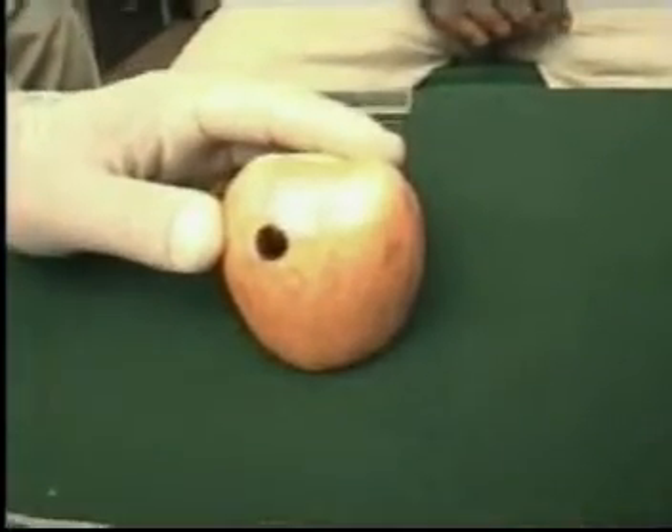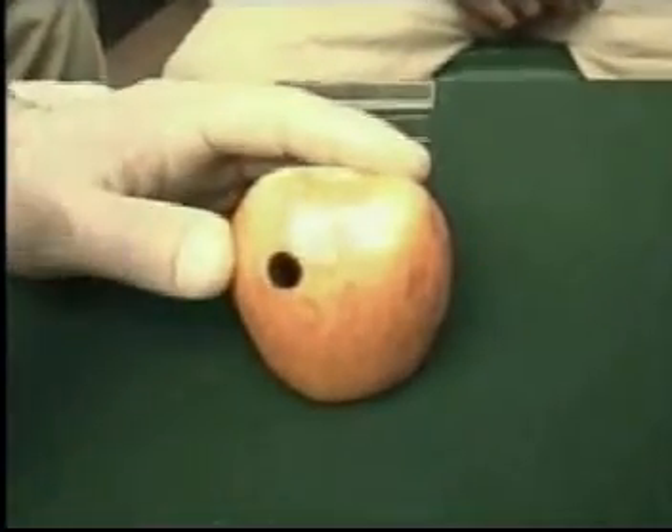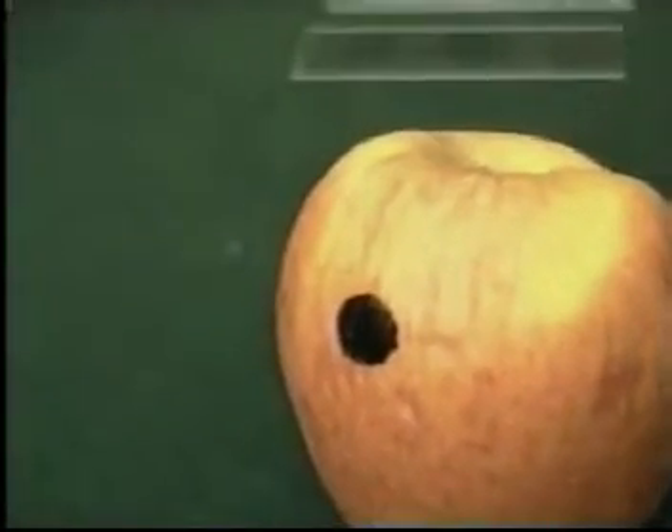Now if you look at this apple, this is a simulated growth — let's say in the breast or in the thyroid. The black spot marks the area of the skin under which this lesion lies. Now we shall perform the FNAC.